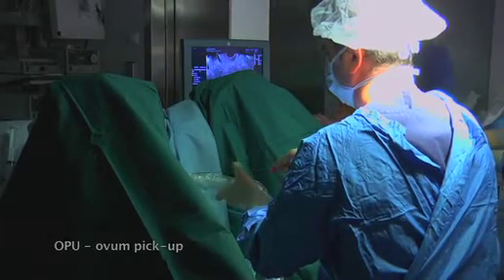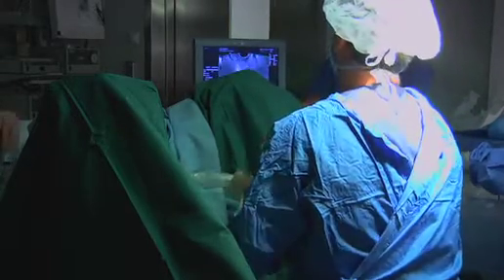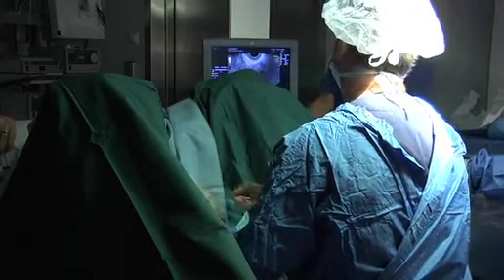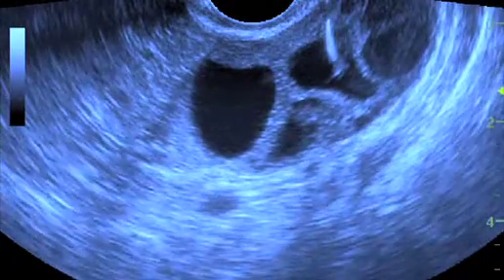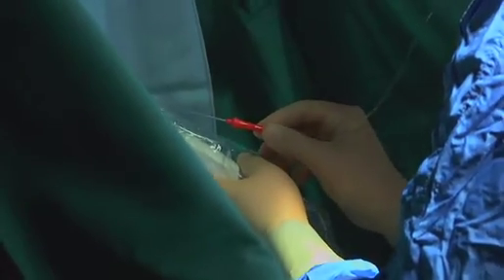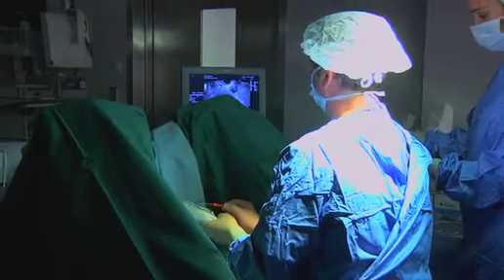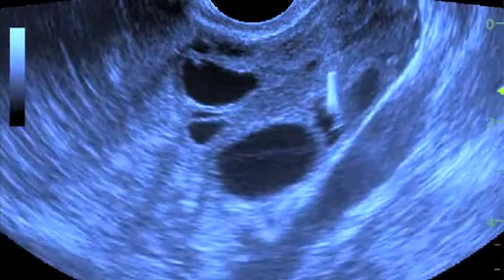The needle is inserted into the needle guide. The follicles are visualized and then the aspiration procedure is started. Here you can see an ovary with several follicles. When the right position is reached, the needle is inserted inside the follicle and the follicular fluid is then gently aspirated. The fluid will go through the needle and the tube directly into the collection tube. When the follicular fluid is collected, a gentle curettage of the follicular wall is performed in order to increase the chance to retrieve the oocyte.